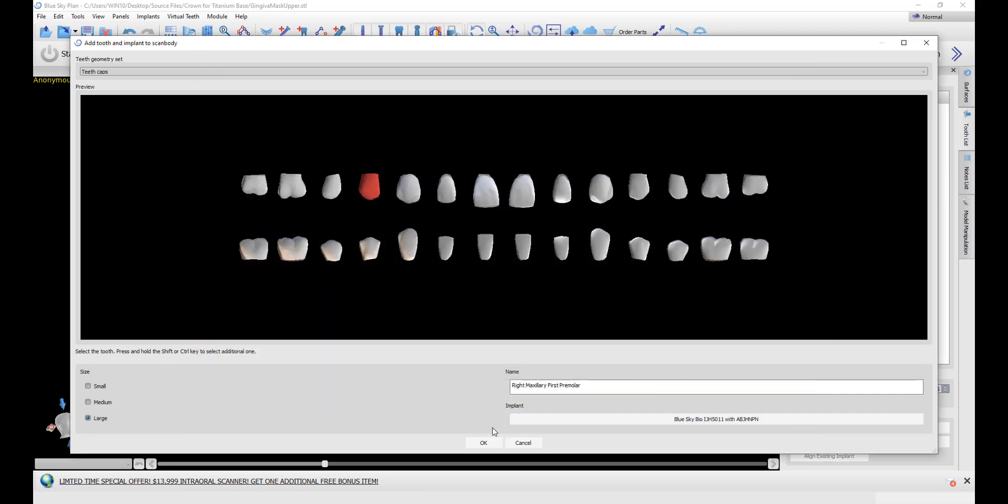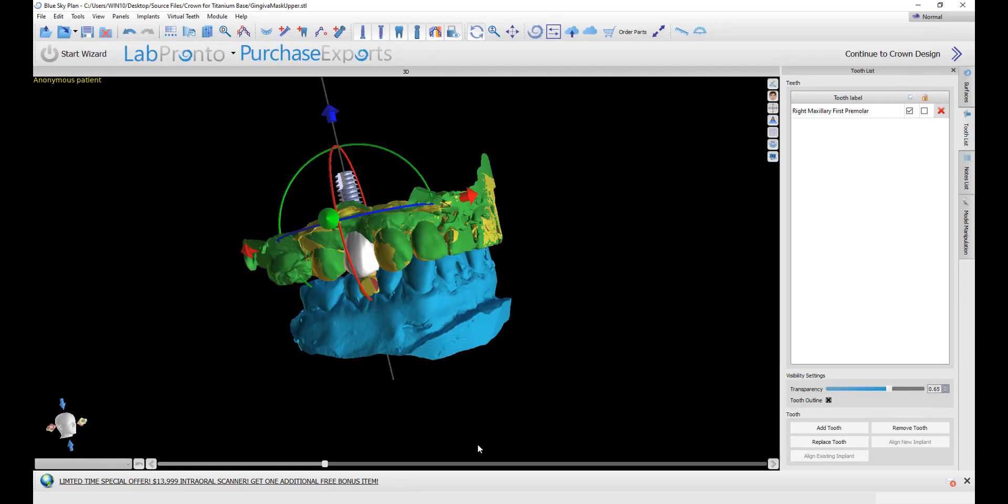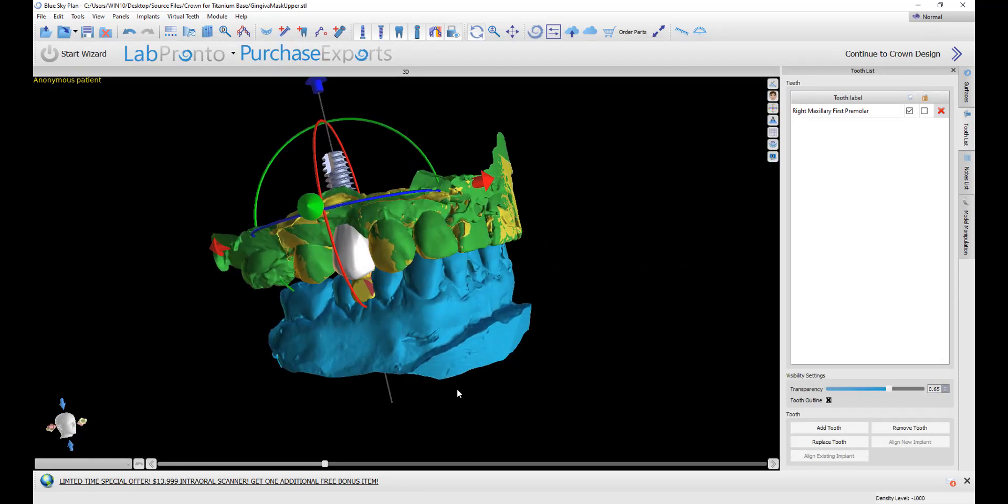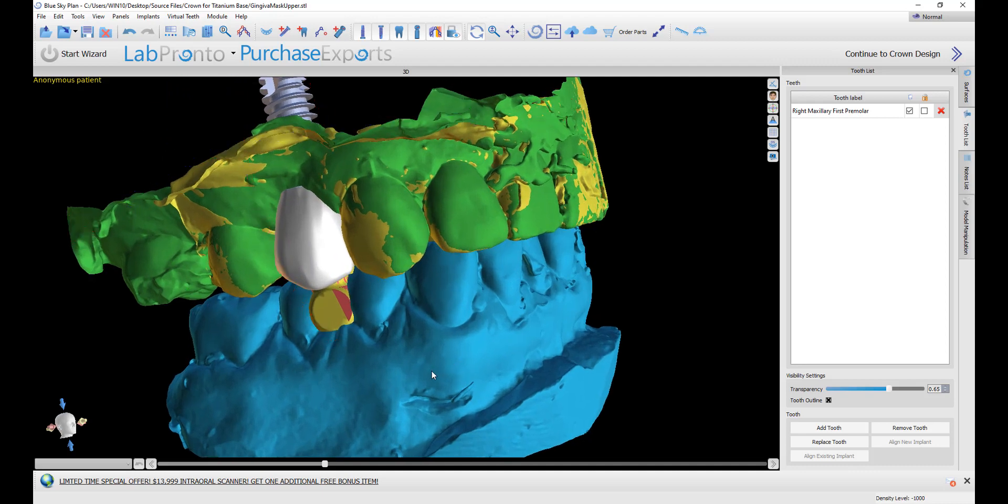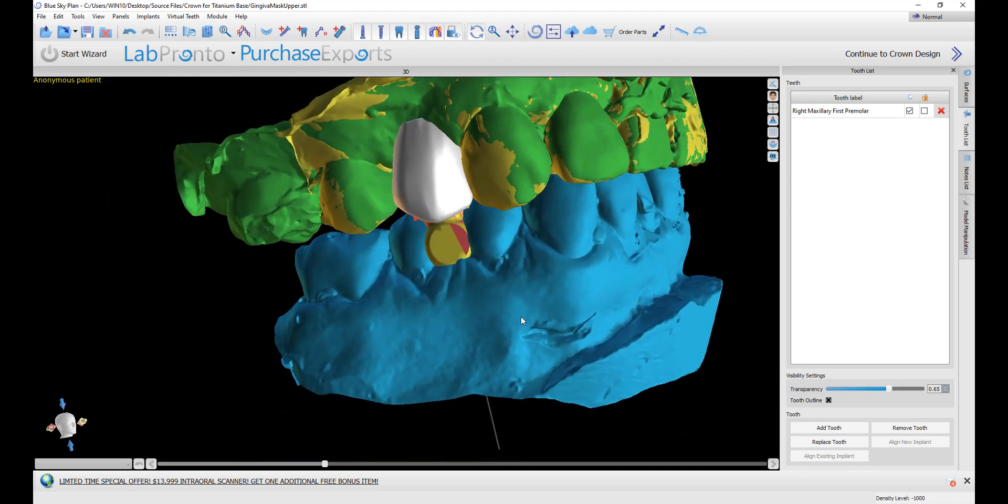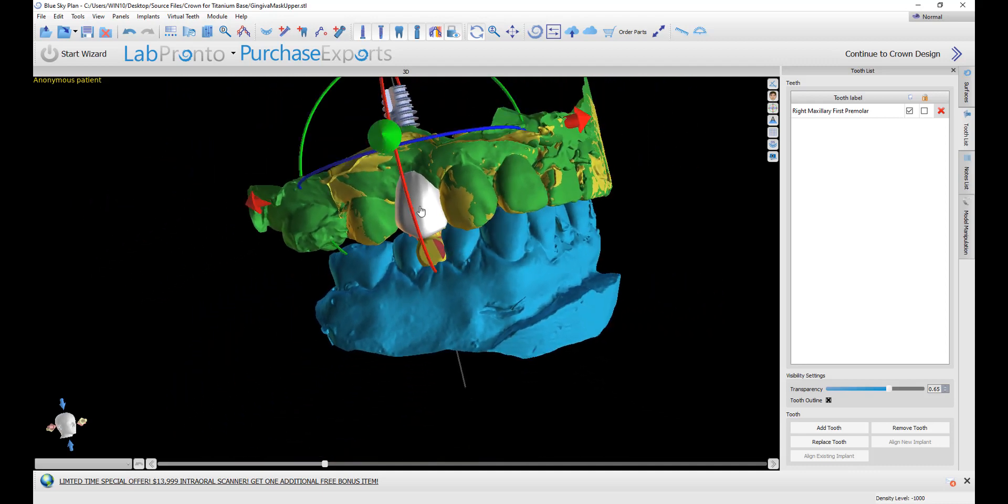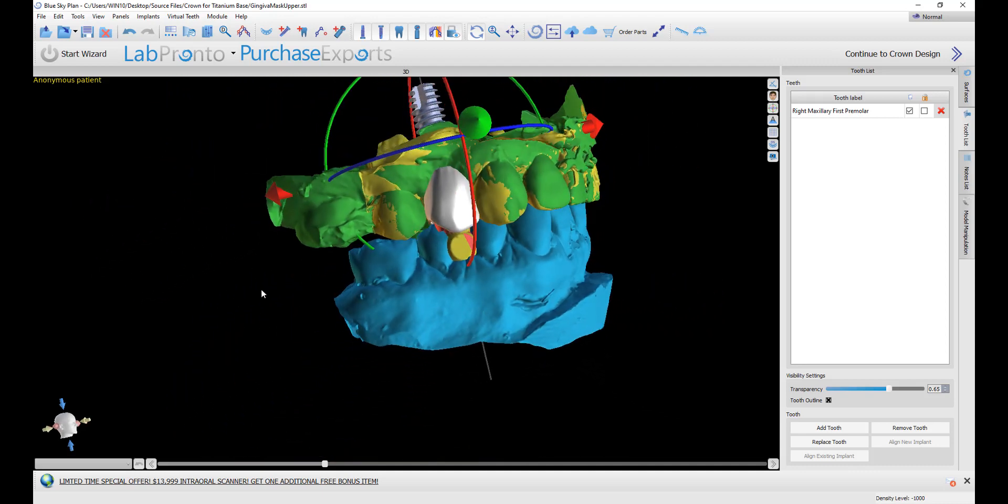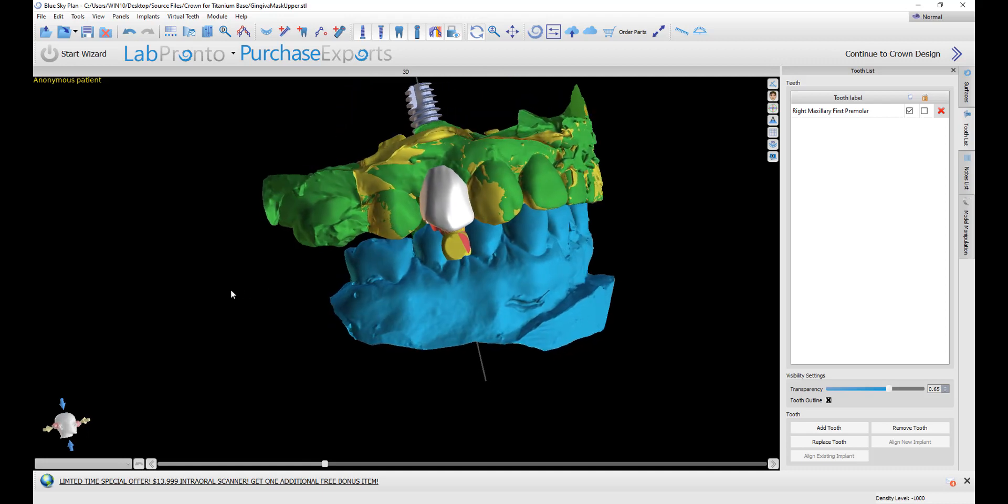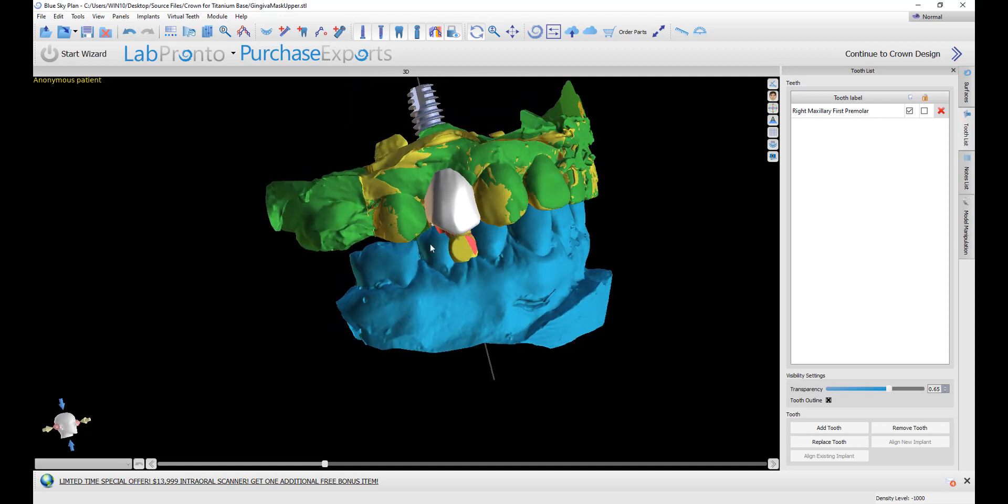Then confirm again by clicking OK. The software now automatically aligns the tooth, the implant, and the abutment to the scan body.